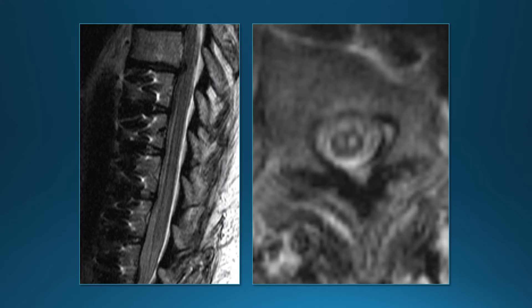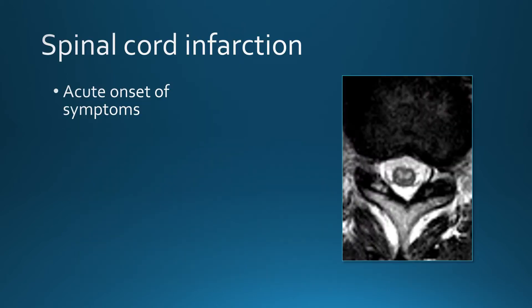This patient developed fairly acute paraplegia immediately following spinal fusion. The patient has a fairly extensive spinal fusion and after waking up was noted to have bilateral paraplegia with bright signal within the central gray matter and anterior horns — this is an example of spinal cord infarction.